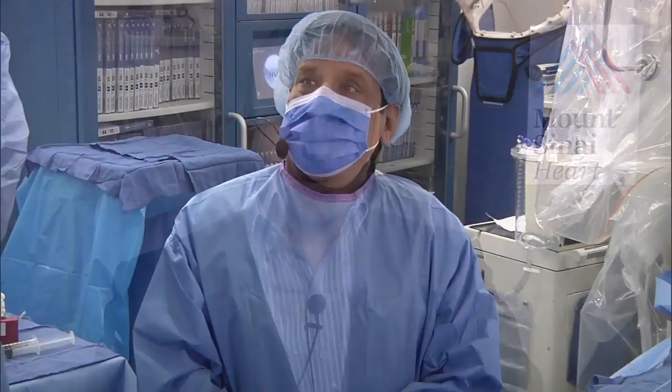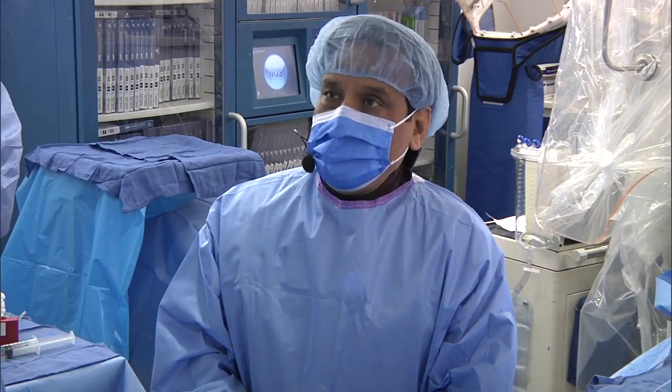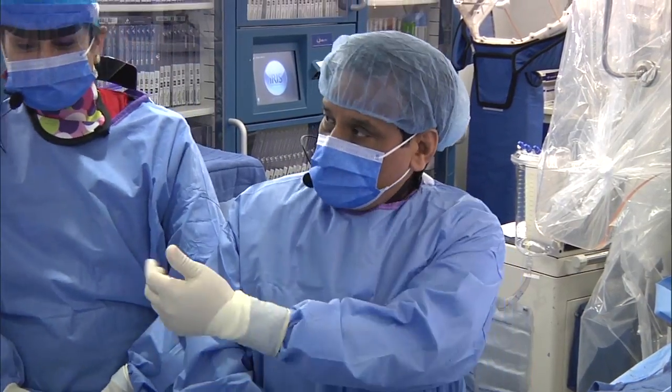Today we are pleased to join Dr. Samin Sharma for a transcatheter aortic valve replacement. Welcome, Dr. Sharma. All right, well, with our team here, welcome for our third series in a row, and everybody should be there.